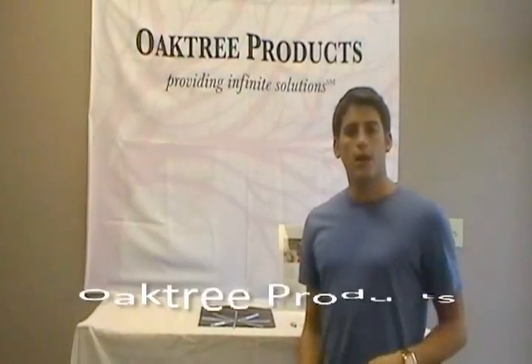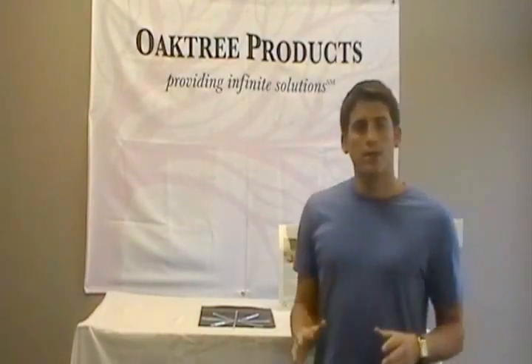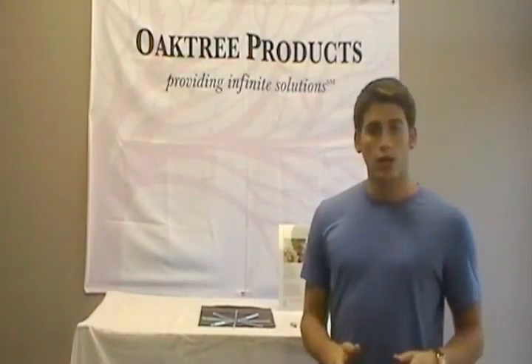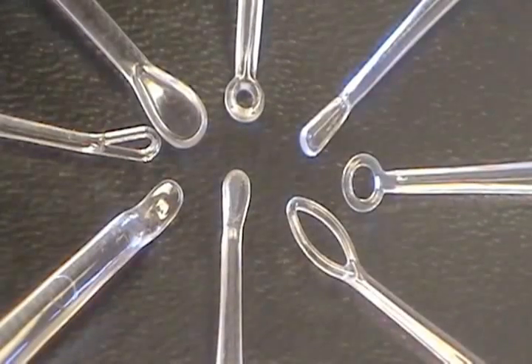Hi everybody, this is David Kemp with Oak Tree Products and today we're going to take a look at a popular product called the Bionics Lighted Curette. This product is great because not only is it a disposable instrument for removing cerumen, but it also provides magnification and illumination to help you better see what you're doing. Also, it's available in a number of styles as you can see here.